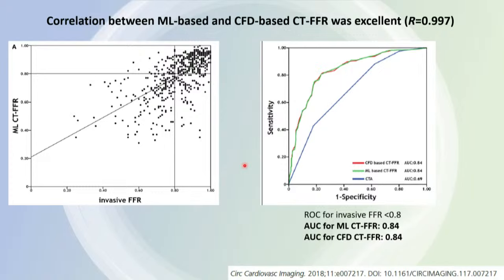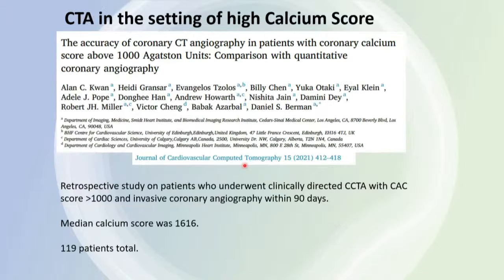And so when we talk to the vendors that are coming in the space, clearly HeartFlow is one big one. They'll say we also give you the ischemia score. There are multiple vendors. I'll show a slide for that. And what is that ischemia score? That ischemia score is based on one of these anatomical machine learning algorithm derived CT-FFR.